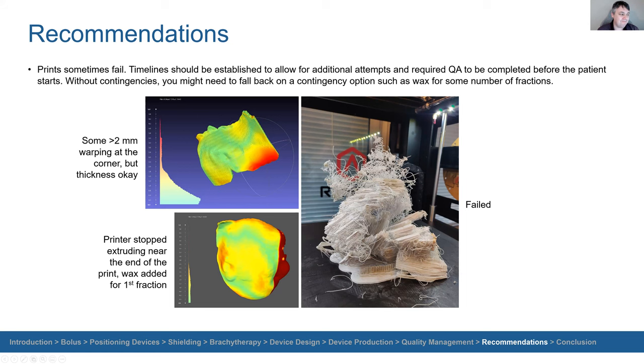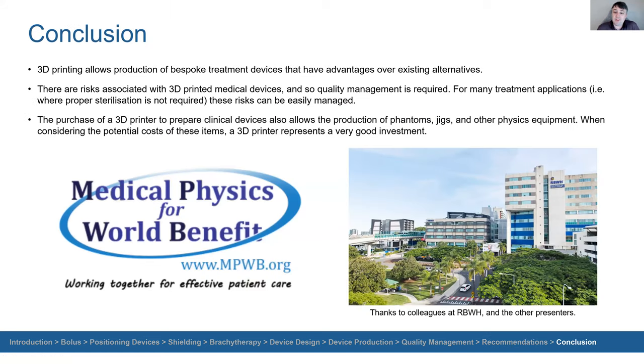So in conclusion, I think 3D printing allows the production of bespoke personalized devices that often have advantages over current existing alternatives. There are risks associated with 3D printed medical devices. You should have some sort of quality management system in place. For a lot of applications, I would say that those risks are easily managed, unless it's getting put inside of a patient, or there's exposure to fluids, for example.